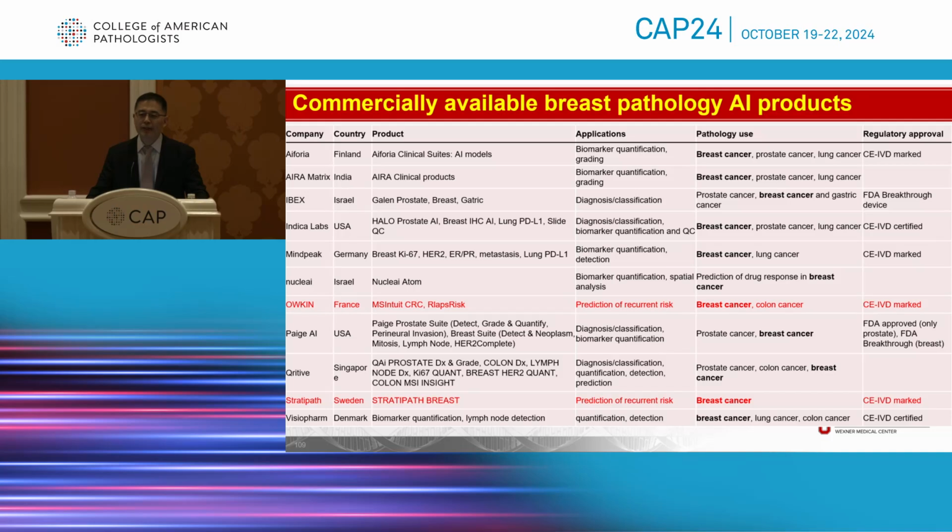These are targeting ER-positive, HER2-negative breast cancer patients, and hopefully they can at least reduce the ordering of Oncotype DX and reduce the cost for the patient. They are out there. They received the Europe CE mark, but have not received FDA approval here in the US yet.